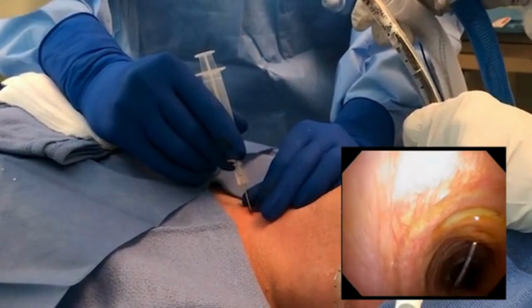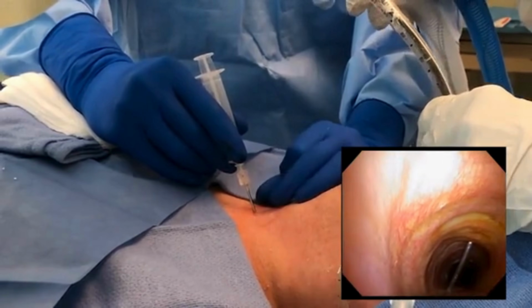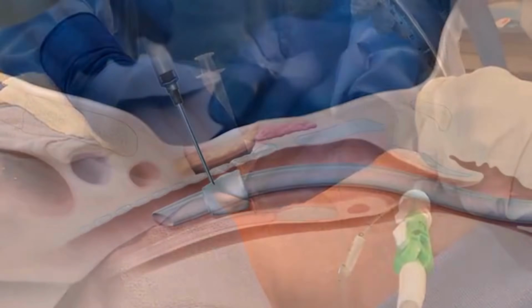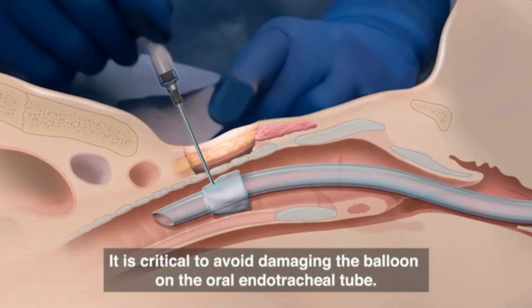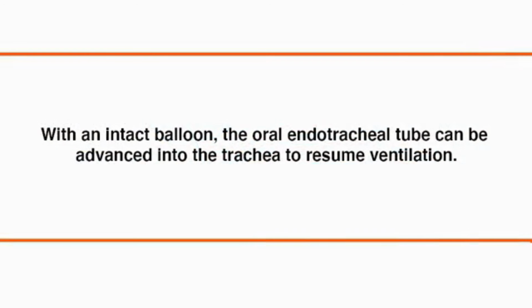If the patient becomes unstable or tracheostomy is difficult with the intact balloon, advance the tube to its original position and resume normal ventilation. Gather additional supplies or personnel. If the balloon is compromised, positive pressure ventilation is lost. Establish a new airway quickly via tracheostomy or oral endotracheal intubation with an intact tube.